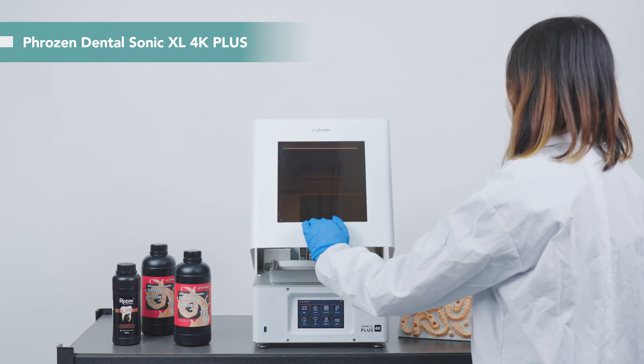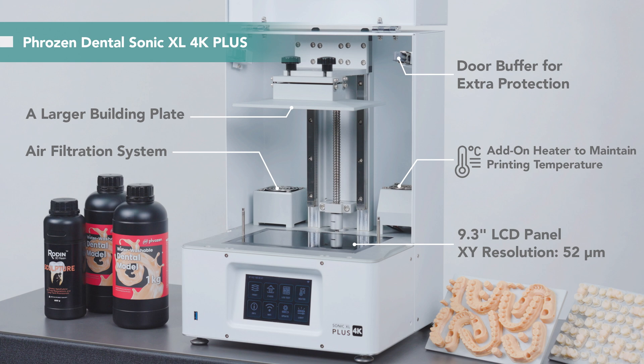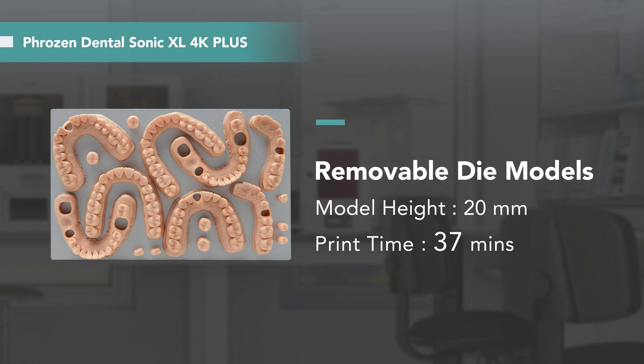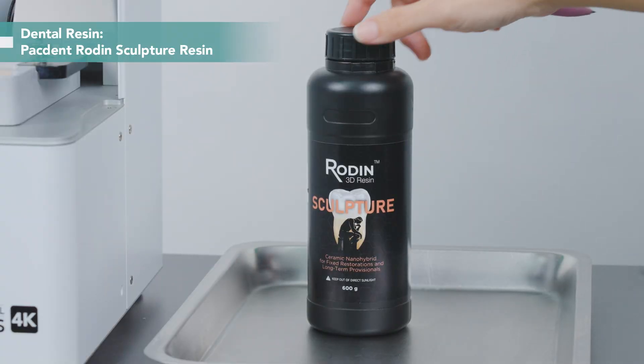This is the Phrozen Dental Sonic XL 4K+. To improve the dental 3D printing process, it is equipped with a new mainboard system and an improved heater for a more stable printing environment. With a larger building plate, we can print 50 to 150 crowns and bridges at a time. Additionally, if you want to print models, you can also fit up to 12 working models per plate. Today, we use the Pacdent Rodin Sculpture resin to print our crown.